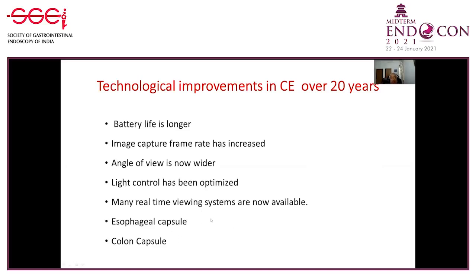Esophageal capsule and colonic capsule have also come in. Not too much used in our country, and I've not gone into it in this lecture due to lack of time.